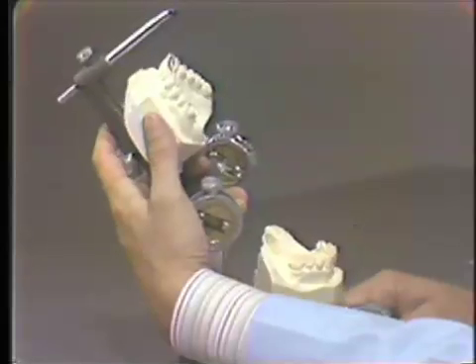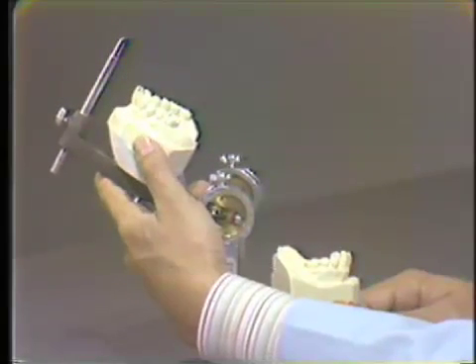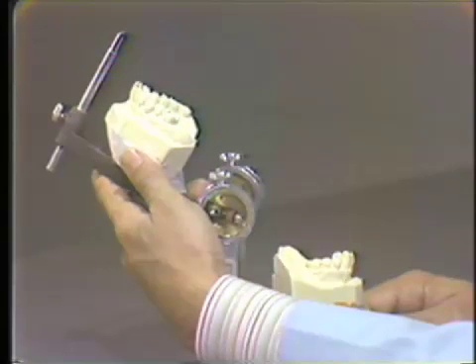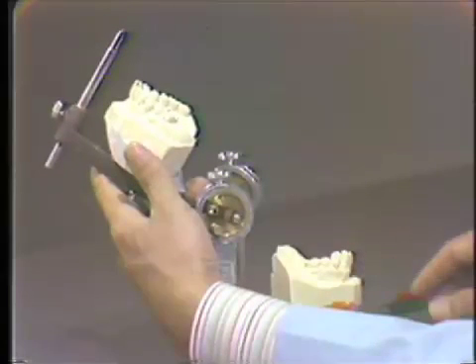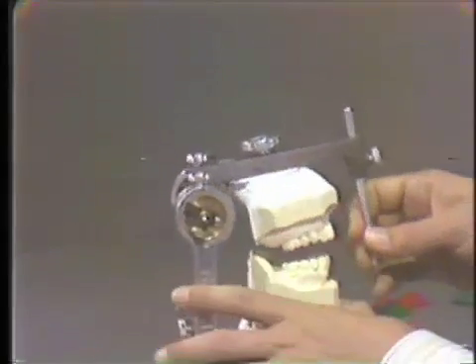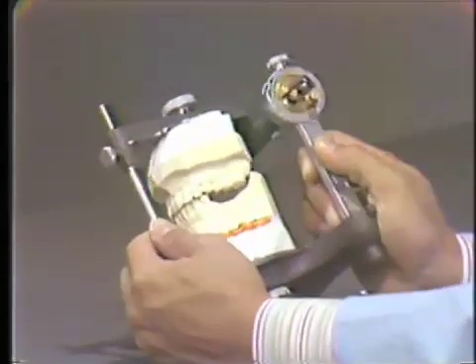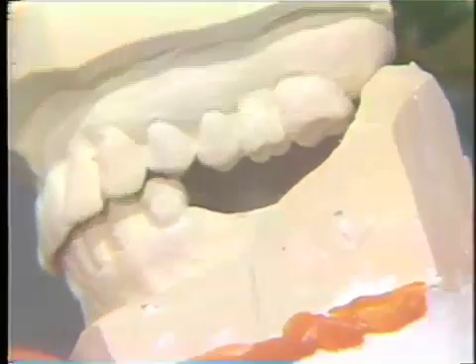However, we will have to double check this after adjusting the centric and the lateral excursions. After they are adjusted, it is possible that the lowering of the vertical dimension in the eccentric position from adjustment of working guidances could pick up balancing contacts. We've now checked both working and balancing on that side. Looking at the opposite side, terminating in the bicuspid area, we see there is no balancing contact on that side either.